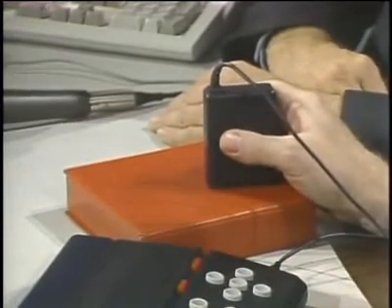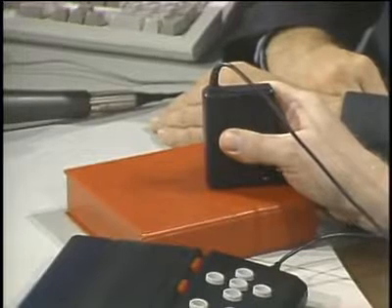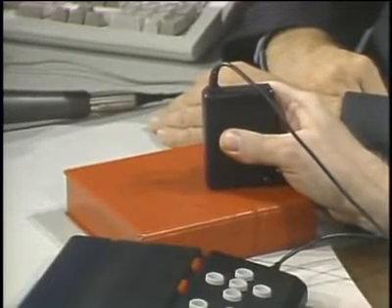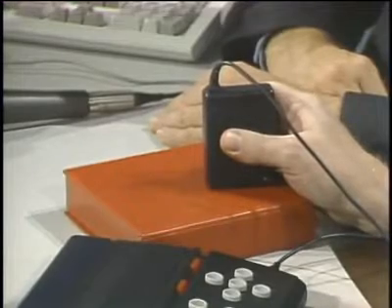So we're going to put it on here. Going to press a function key, and it's analyzing the length of the waves. It says it's maroon. Now we ought to slow it down and do it once more because it said maroon pretty fast. That's an Australian accent, you know, and it takes a little catching on to.